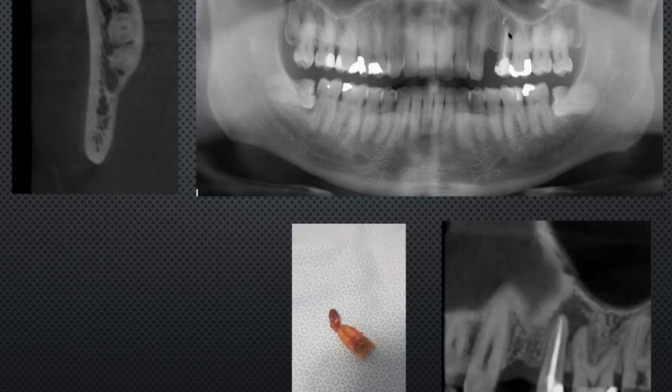Now the reason I give is, if you're doing it as a single stage versus a 2-stage, it doesn't make it any quicker. You still have to wait for those 3 months. Biologically, it's 3 months for mature bone, essentially, and full osseointegration. And you're not going to start loading the implant earlier than that, if you want it to work. So rather than have a healing abutment sticking out through the gingiva, being constantly traumatized, getting dirty, attracting plaque, potentially compromising the osseointegration, I'd rather just bury it.